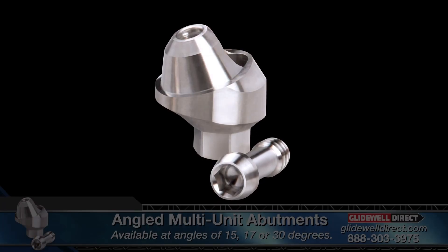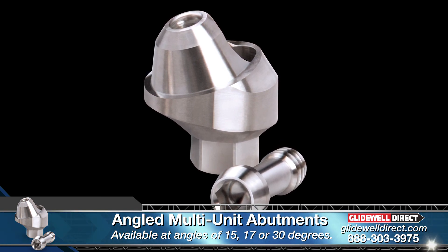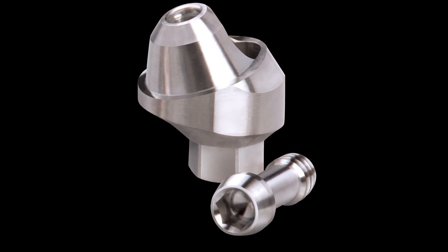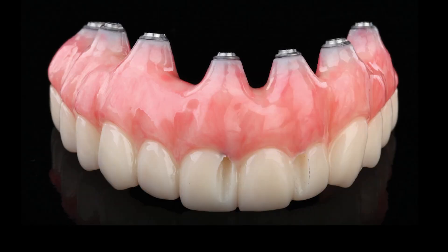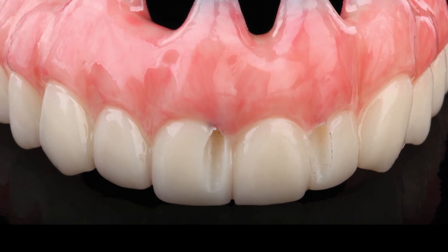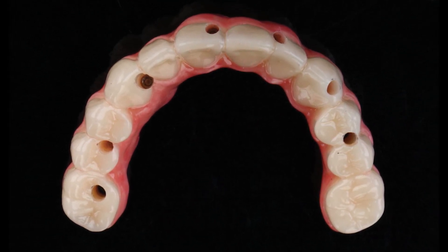Additionally, angled multi-unit abutments are used to correct the angulation of implants, helping to keep the screw access holes away from the facial surfaces of the restoration while also improving the path of insertion. In some cases, failure to use multi-unit abutments can create issues, from screw access holes on the facial surface of the teeth, to prosthetic connections that make it difficult to establish proper draw and fully seat the restoration.